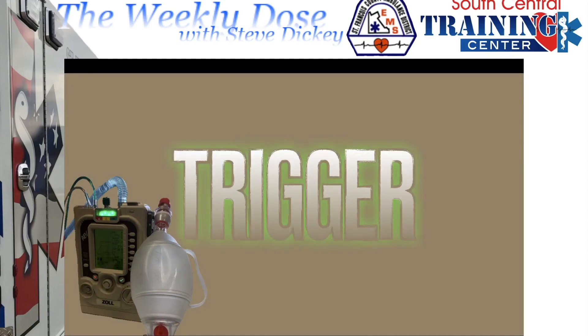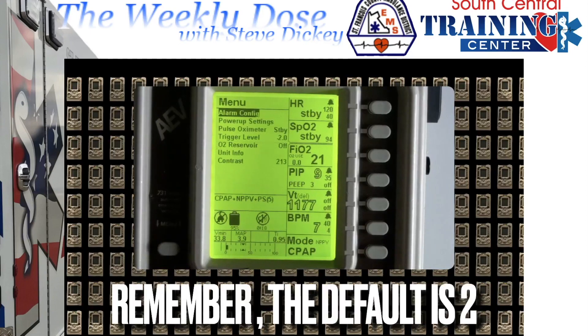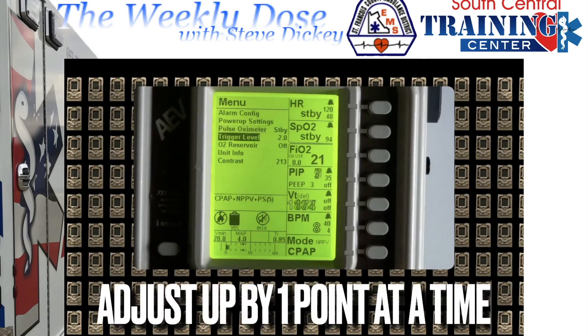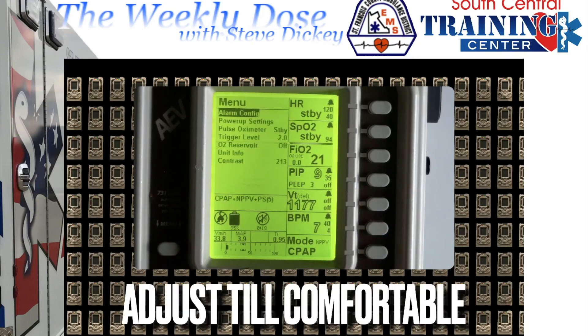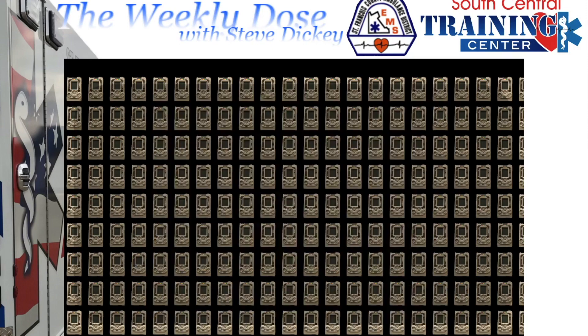Adjust the trigger. Remember, the default is 2. When you go up in this number, the settings become a lot less sensitive, so it's going to take a stronger breath to trigger the ventilator. Simply adjust that until they're comfortable — one value at a time.